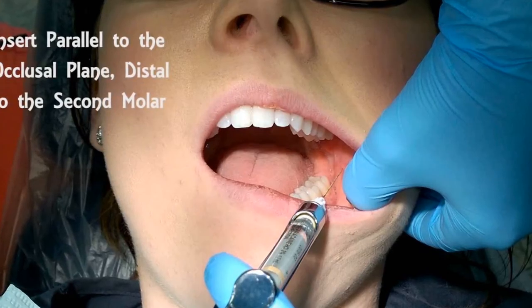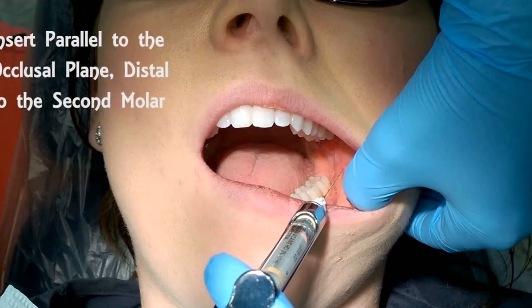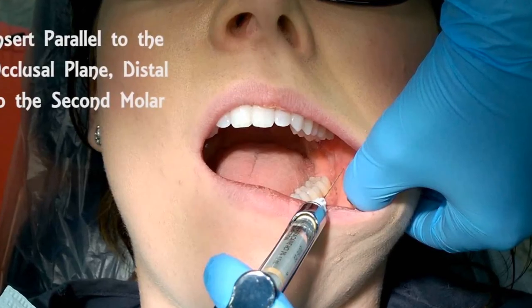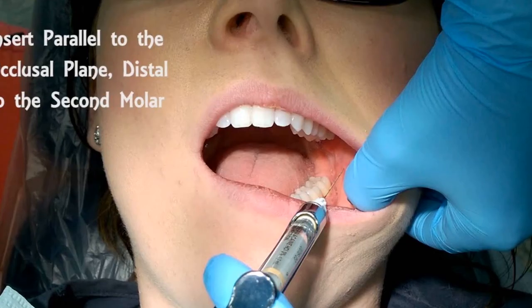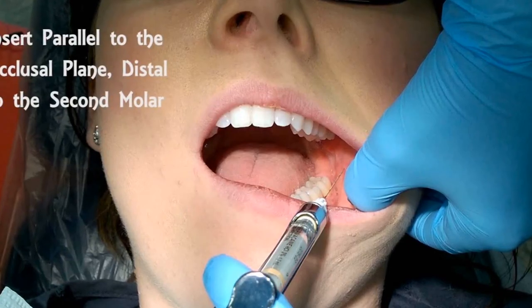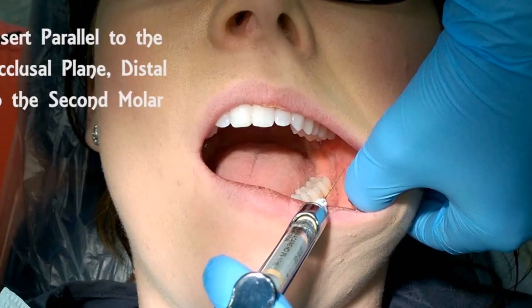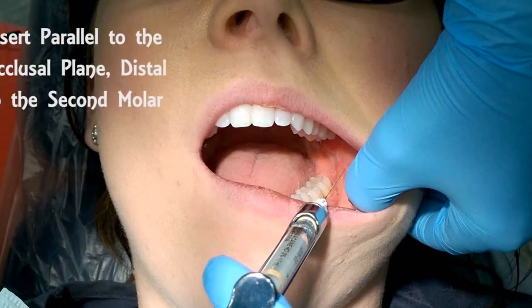If the patient has a third molar, give it at the distal buccal aspect of the third molar. If the patient does not have a third molar, then distal buccal to the second molar. So: at the distal buccal cusp of the last tooth, parallel to the occlusal plane — that is how you give the long buccal nerve block.